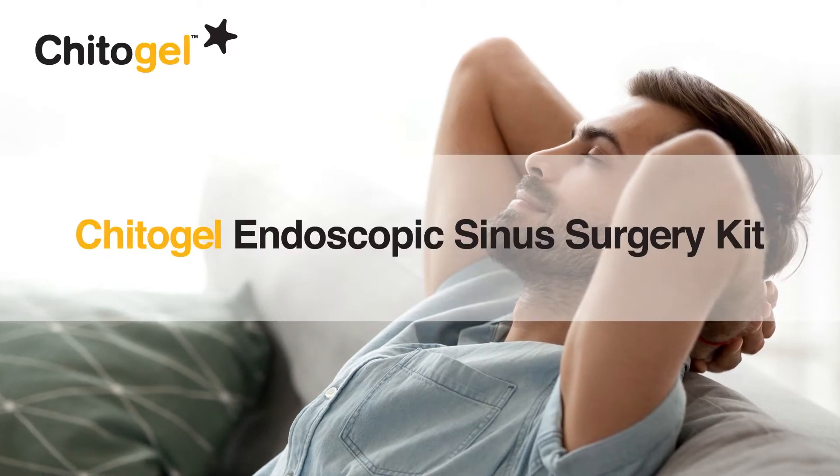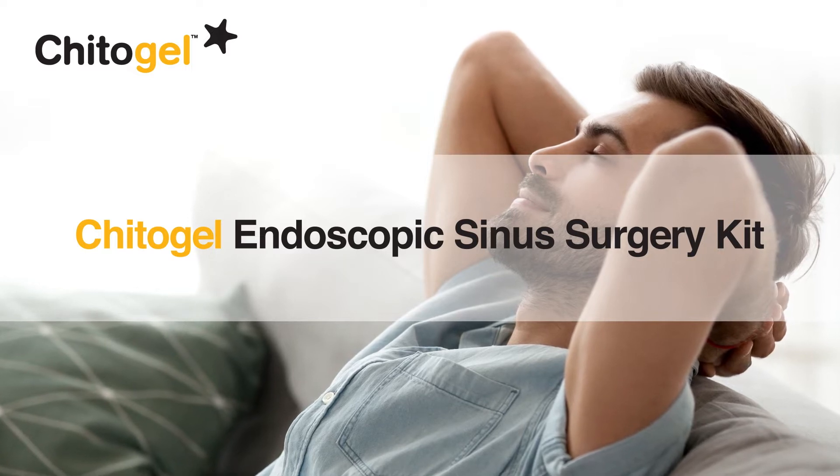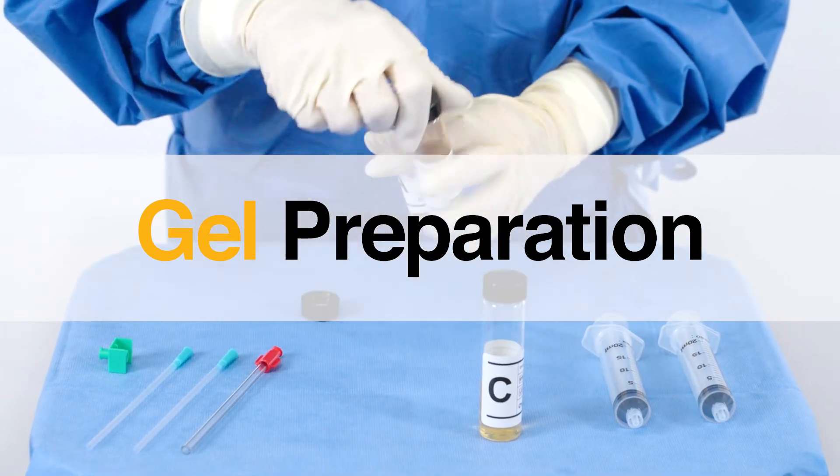Everything you need to mix and apply Chitogel is provided in the Chitogel Endoscopic Sinus Surgery Kit. You can complete the Chitogel syringe setup process during your case preparation.